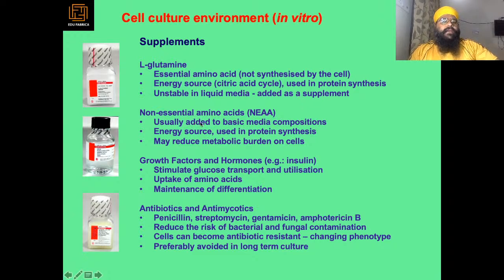And NEAA, non-essential amino acids, added to the basic composition, reduce the metabolic burden on the cells. Then growth factors and hormones like insulin stimulate glucose transport and utilization, uptake of amino acids, and maintenance of differentiation. Then antibiotics and antimycotics protect from bacterial and fungal infection.